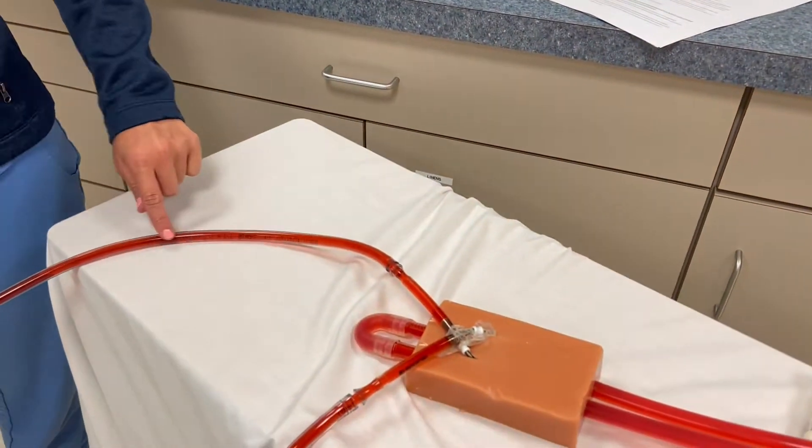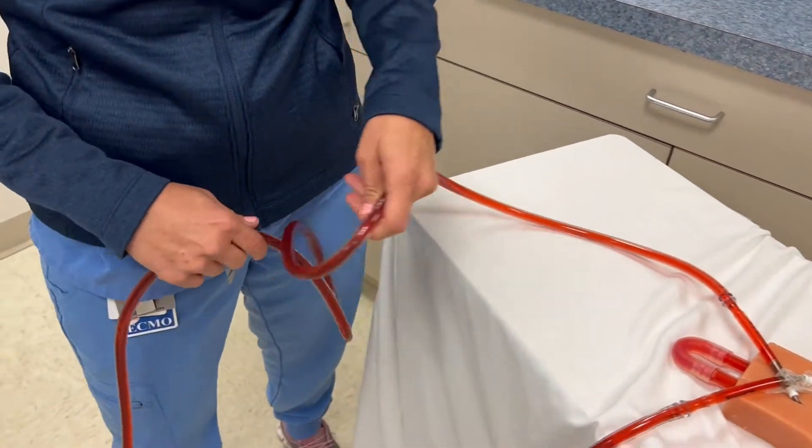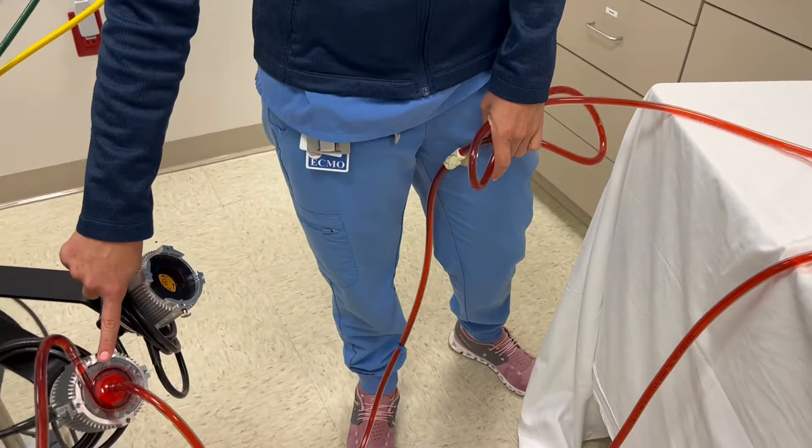Hi, I'm going to walk you through the basic components of ECMO along with the blood flow. We're going to start off at where your venous blood would be drawn from the patient and pulled into the ECMO circuit. As venous blood is pulled into the ECMO circuit itself, it's drawn in by a centrifugal pump head.